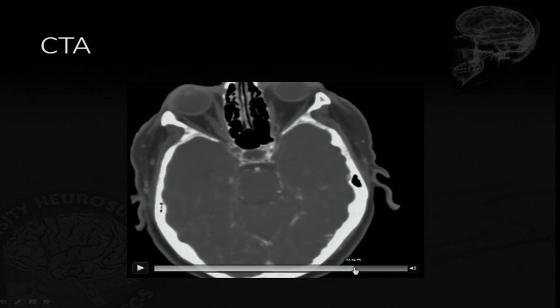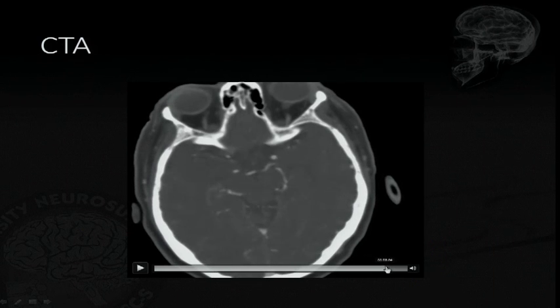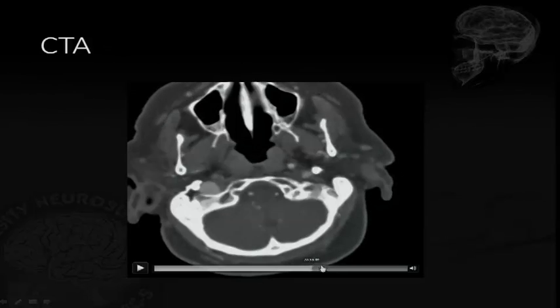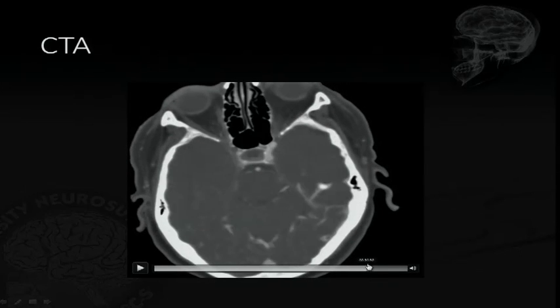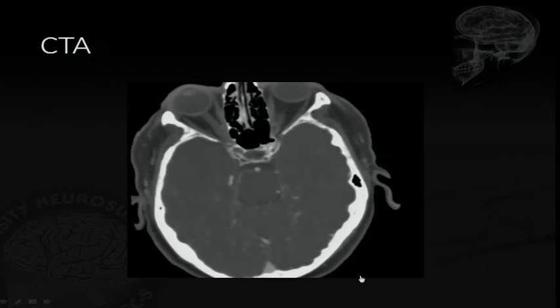So that's where you want to look, and then you go back and look at your basilar artery, and your basilar artery is open, and your left MCA is open. And then you look at your reconstructions. But this is what you're going to be scrolling kind of quick in the control room, because you're going to be more engaged. At this moment you're going to say, let's do a CT perfusion, okay? And you can add the order in, or you can have neurology add the order in.